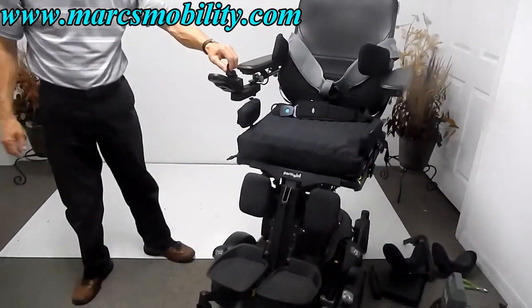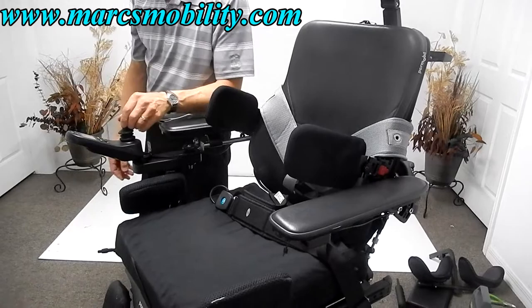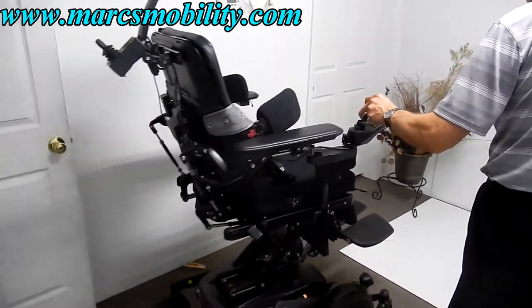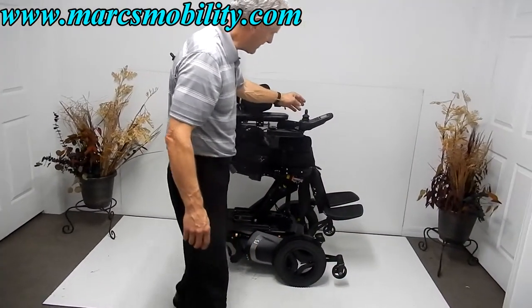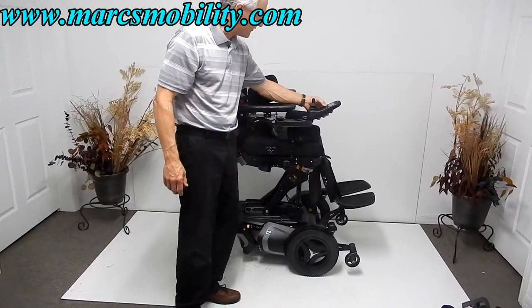Of course, driving with the seat elevated is at a reduced speed. On profile number two, the chair doesn't turn very fast, but you can still drive it with the seat elevated — at a much reduced speed for safety, since you are sitting 14 inches off the ground.